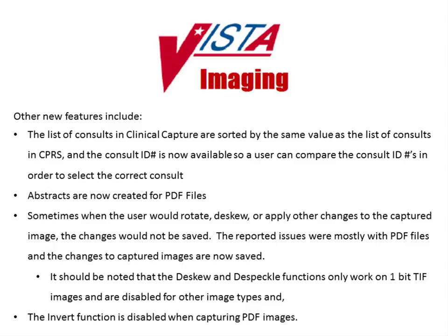Other new features include the list of consults in Clinical Capture by the same value as the list of consults in CPRS, and the consult ID number is now available so a user can compare the consult ID numbers in order to select the correct consult. Abstracts are now created for PDF files.